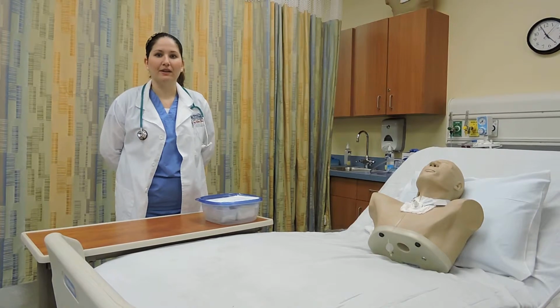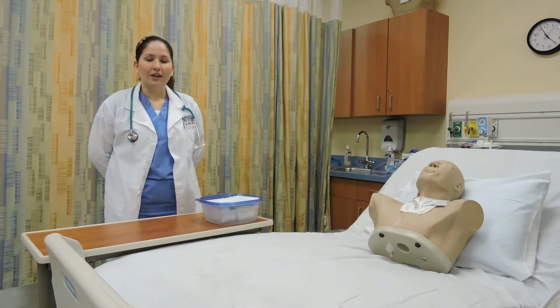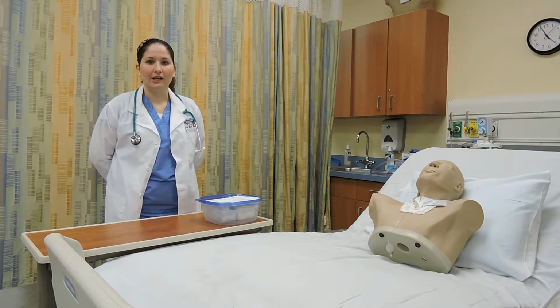I'm an RT student from Miami-Dade College Medical Campus. Today I'll be making a video on how to perform trach care. Trach care is indicated for all patients with a tracheostomy tube in order to maintain the skin integrity and to avoid infections.